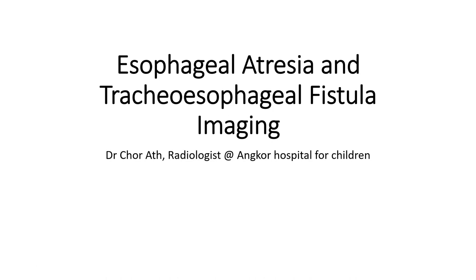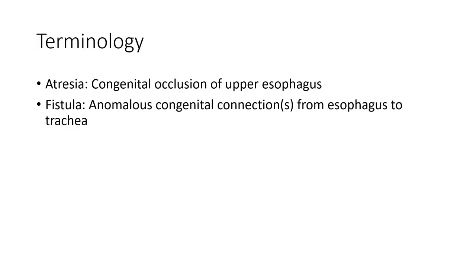Hello everyone, today I'm going to show you about esophageal atresia and tracheoesophageal fistula imaging. Terminology: atresia means congenital occlusion of the upper esophagus. Fistula means an anomalous congenital connection from the esophagus to the trachea.